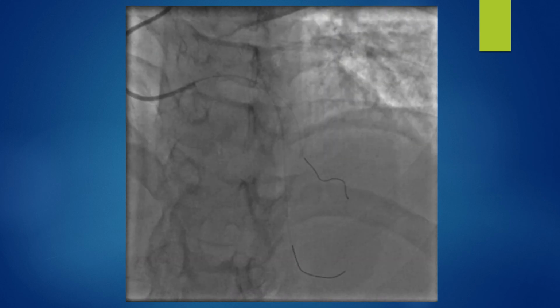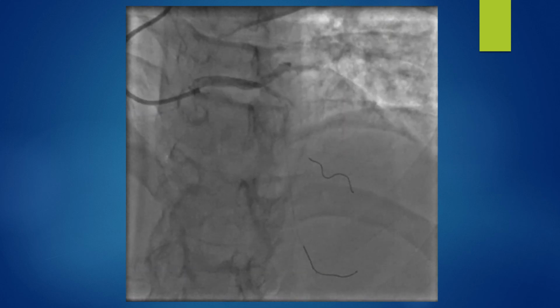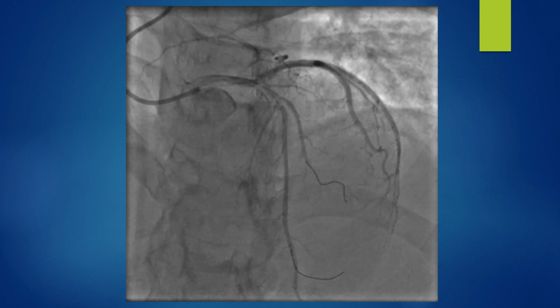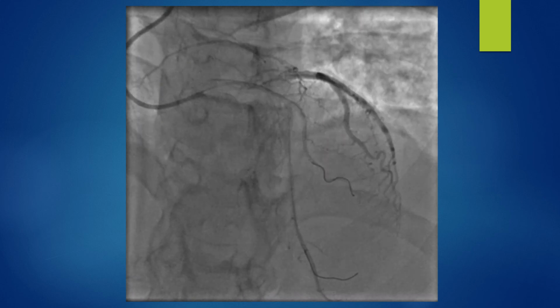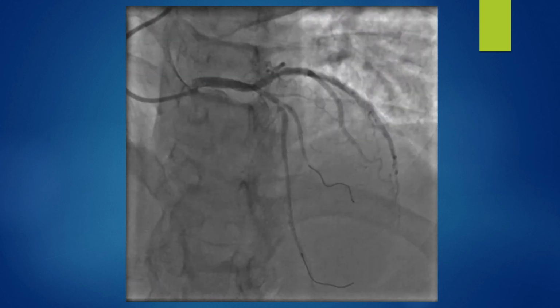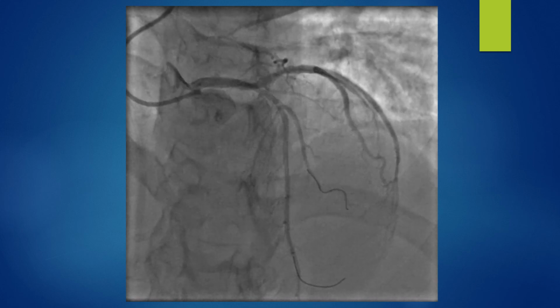I performed this procedure using a 6 French system. Now with the 6 French system, it may be hard to pass 2 stents at the same time. Therefore, I had to use the modified mini crush technique.